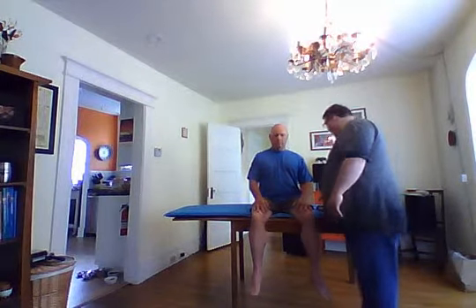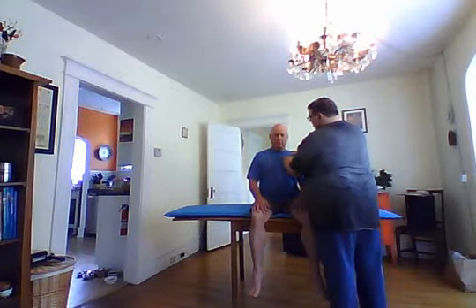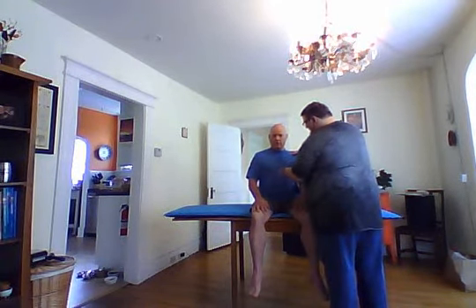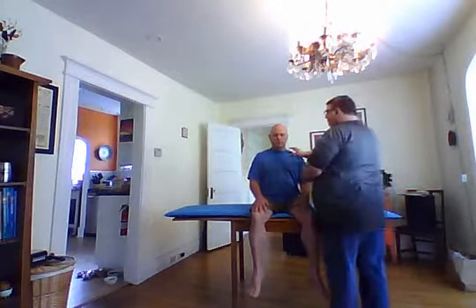So now, I've done percussion and palpation, including tactile fremitus, and it was equal. I did not hear any dullness with percussion. So now I'm going to move to listening. And I'm going to listen for lung sounds. Should hear vesicular sounds. Deep breath, open your mouth. Listening for any abnormal adventitious sounds that would include wheezes, crackles, and rhonchi.